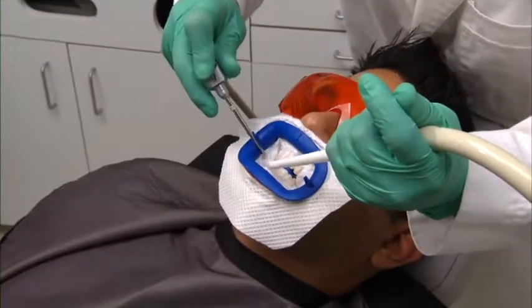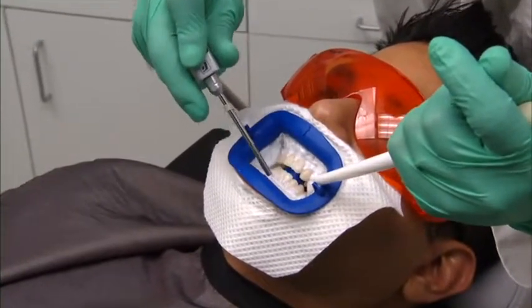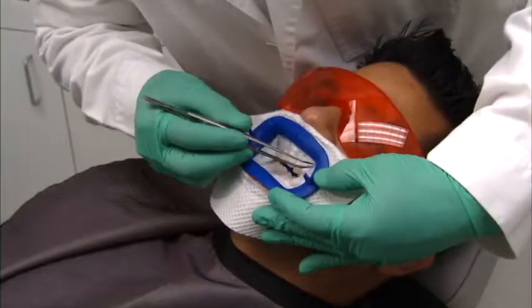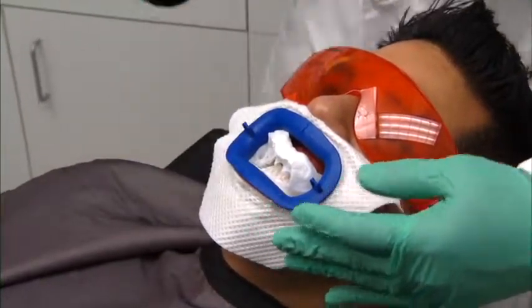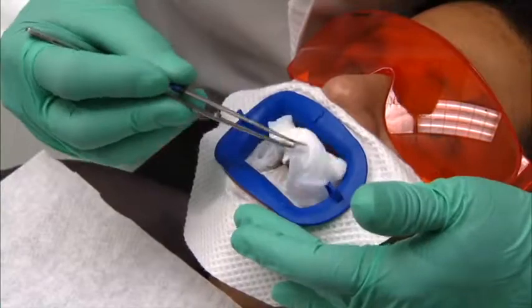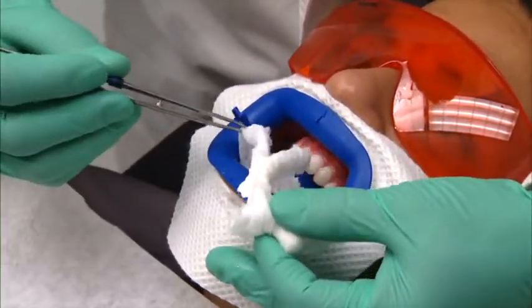It's very important to moisten the gauze and cotton rolls before removal to prevent tissue irritation. Use the cotton pliers to grasp gauze and cotton rolls, then gently pull the material out. All of the isolation materials should pull free from the mouth in one unit.